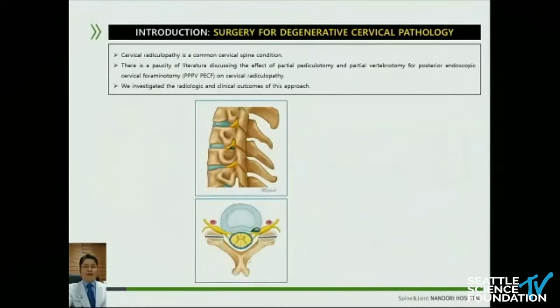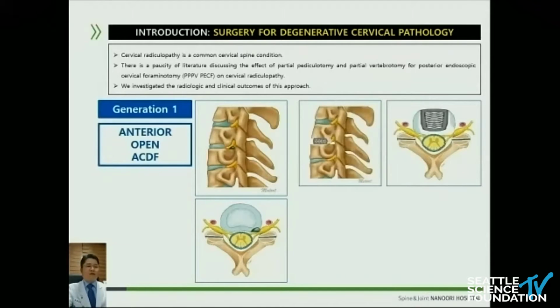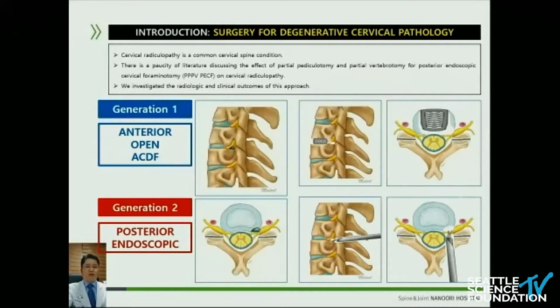As a surgical treatment for degenerative cervical foraminal pathology, ACDF is still considered the gold standard. However, with the recent development of endoscopic spinal surgery, posterior endoscopic cervical foraminotomy and discectomy has replaced many parts of ACDF.